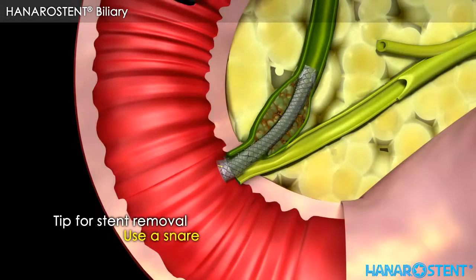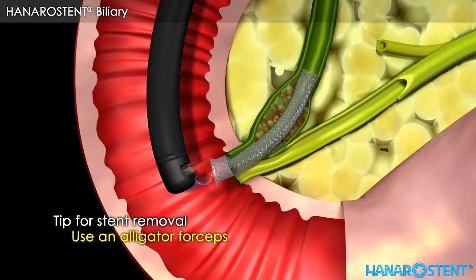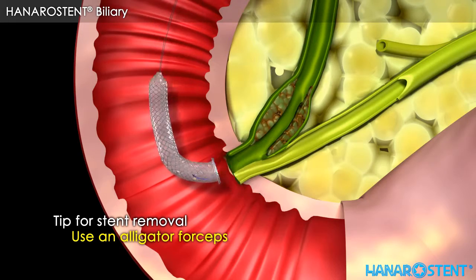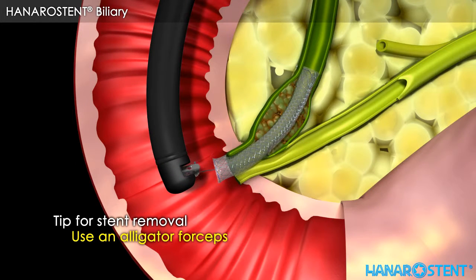Here are tips for stent removal. Use a snare. Pull the long lasso and invert the stent, or pull the short lasso.